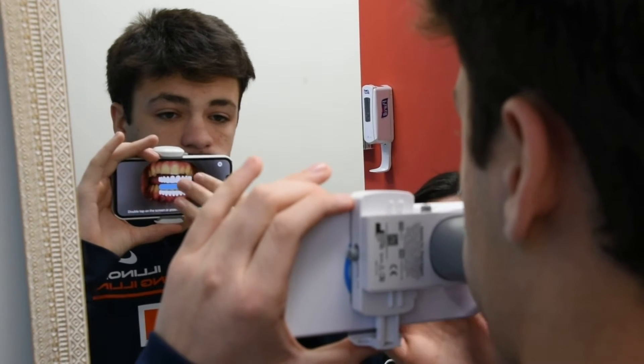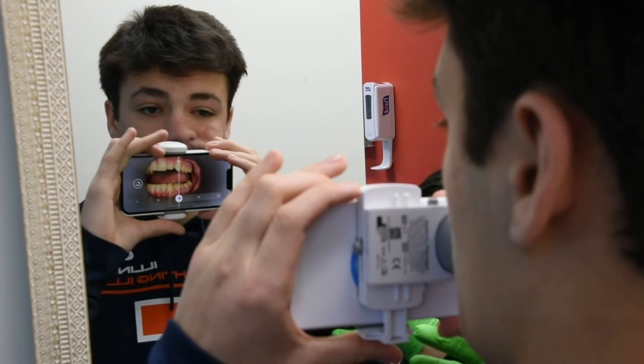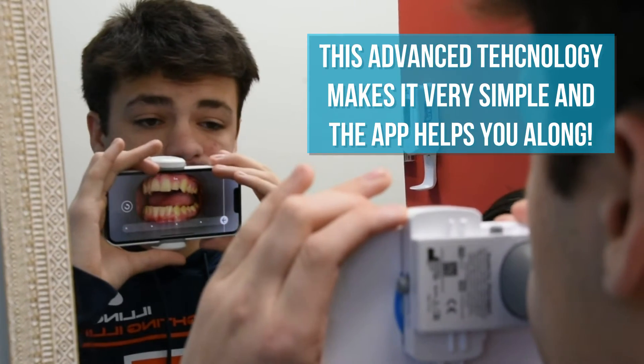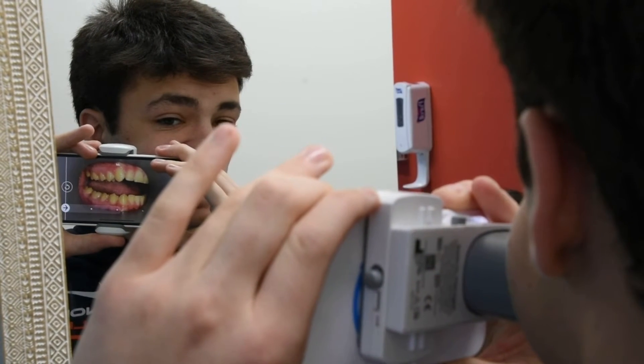There you go. Double tap. Now just shift the scan box all the way to the side of your mouth, nice and slow. Shift the scan box to one side — there you go. Go all the way with the arrow, then shift the scan box to the other side and go all the way to the left, following the arrow all the way. Perfect. Back to the center.